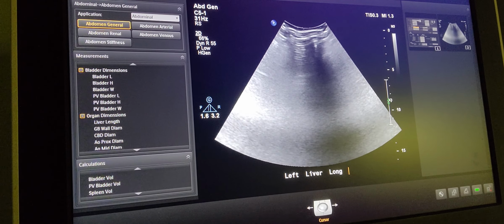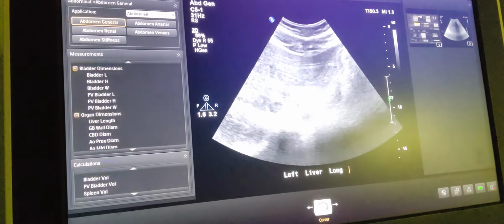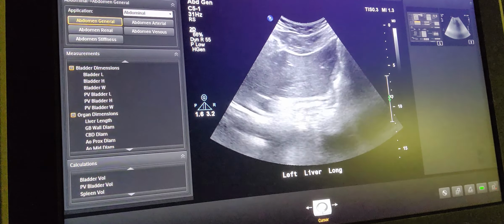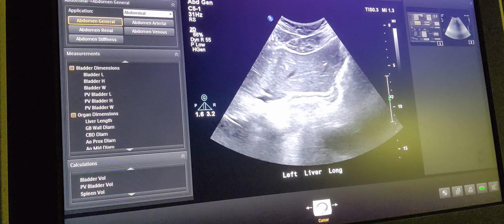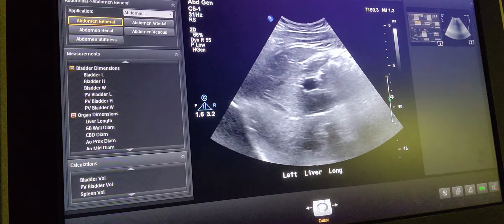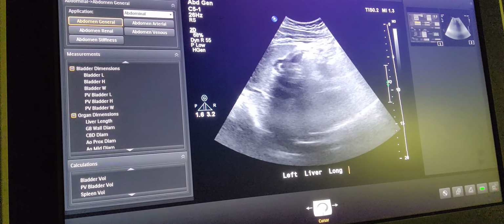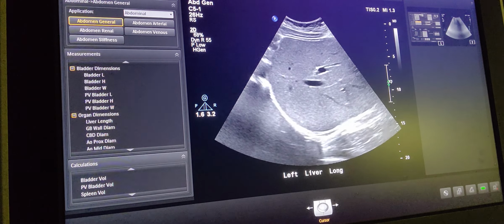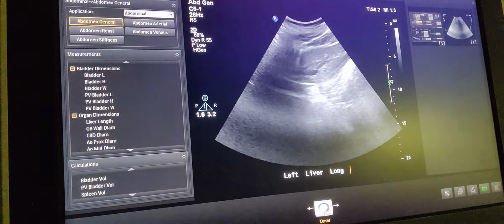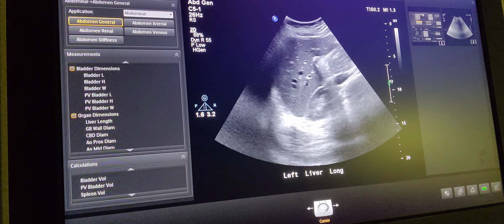Doing a liver demo. So I will be starting off just by looking through the liver, getting my organ mapping down, seeing where everything lays, seeing if there's any pathology that I'll need to document when taking my images. So just doing a few quick sweeps, sagittal and trans, in both the right and left lobe. Can you take a deep breath in and hold? And breathe.